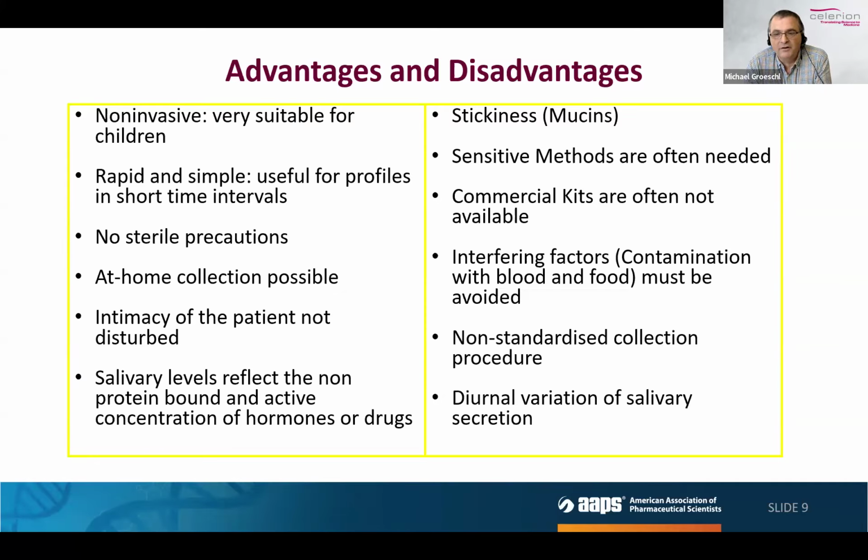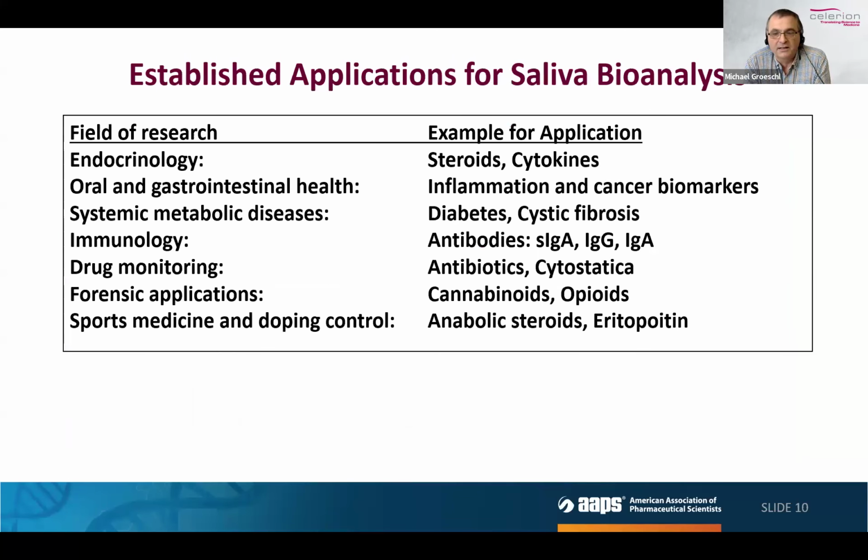Most important, however, is to adhere to a standardized procedure for saliva collection to avoid contamination, and also to consider the influence of varying secretion, for example, due to circadian rhythms. Now let's move on to the application examples.